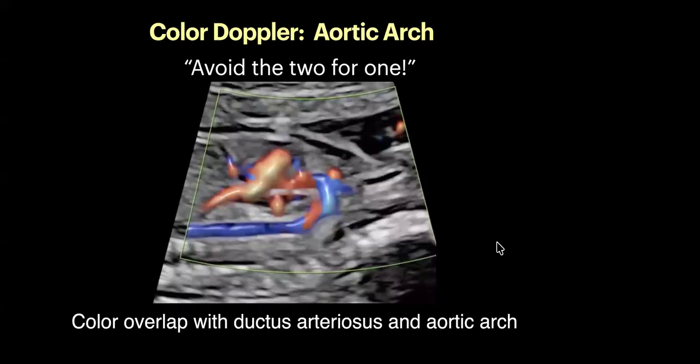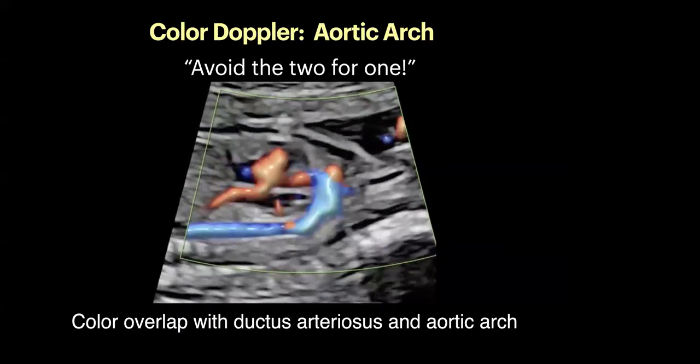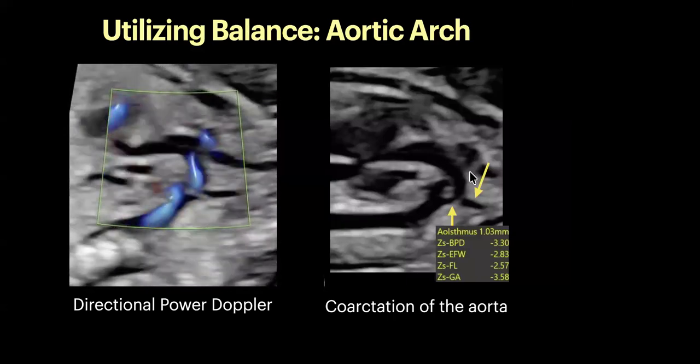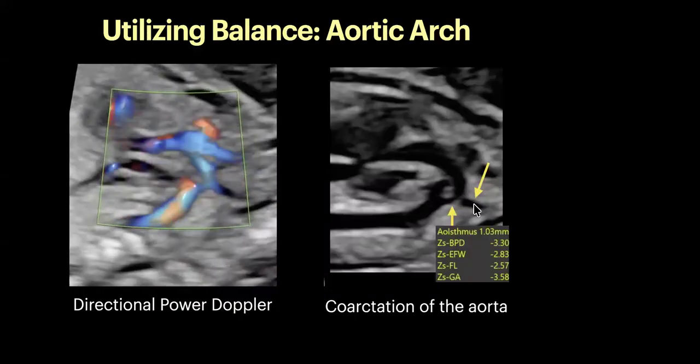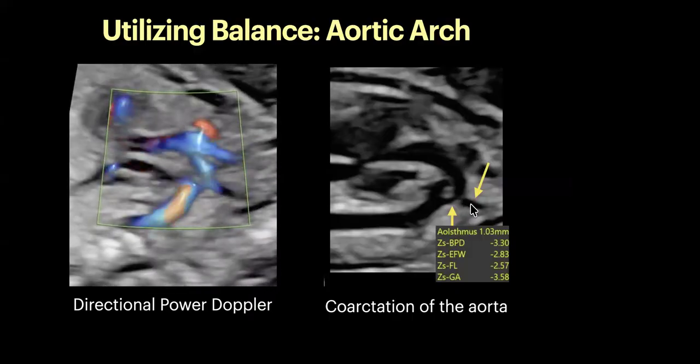Anyways, as she was scanning, I, of course, took over and really optimized. First, I started with the grayscale imaging, and this is actually the same patient here. I went with grayscale imaging, optimized, and was able to really define and separate these views. So looking at the ductal arch here, you could see what looks like the head and neck vessels. There's the subclavian.